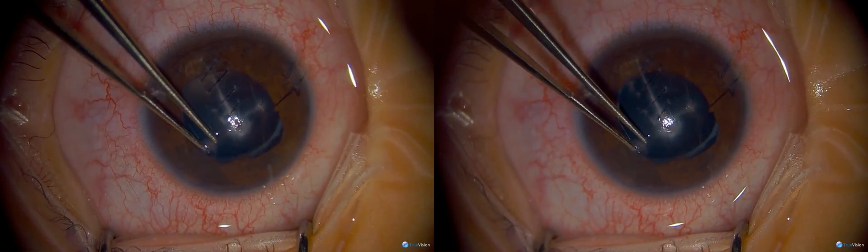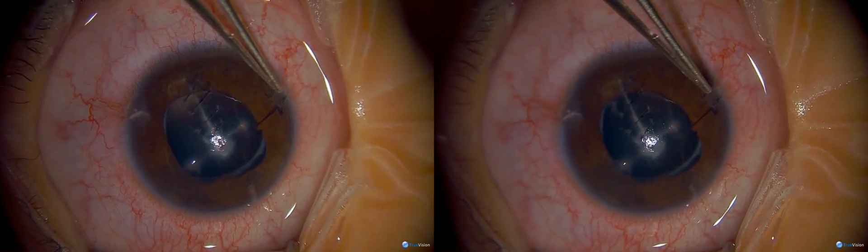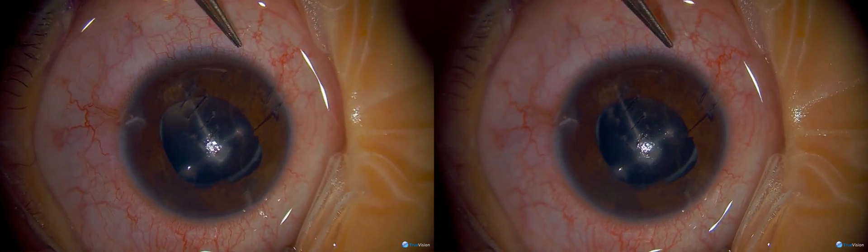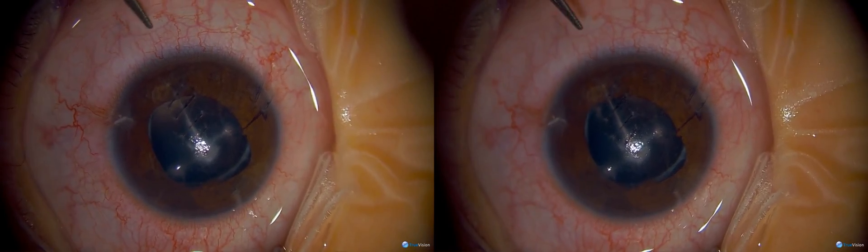I'm going to remove this one stitch here and remove the rest of the stitches at the very end. For secondary lens implants, I like to do scleral tunnels in children. Even for primary lens implants, I prefer a scleral tunnel incision rather than clear cornea.